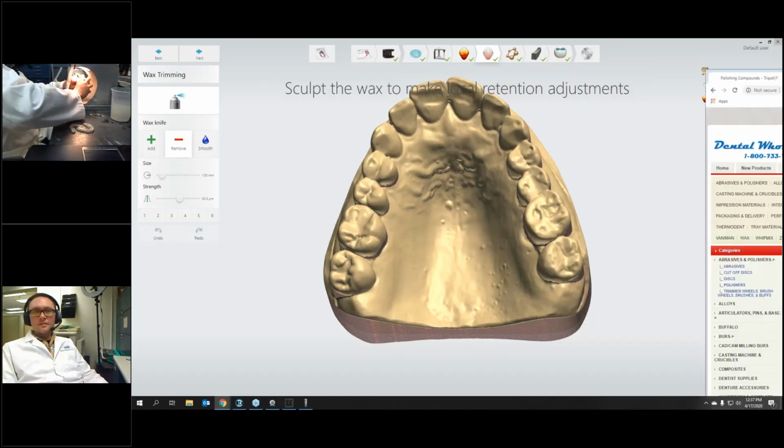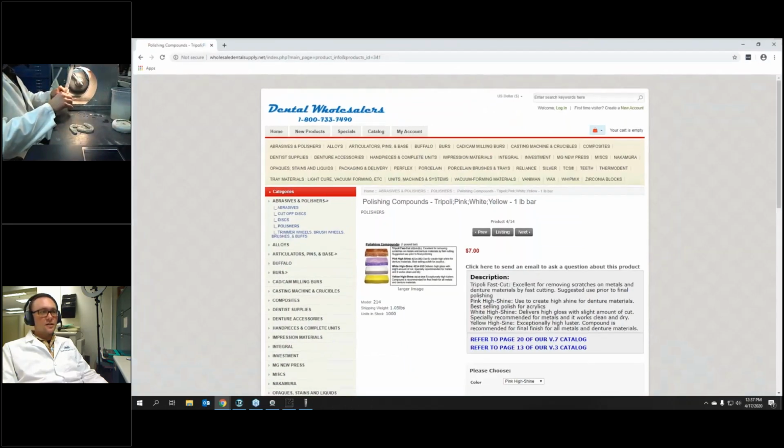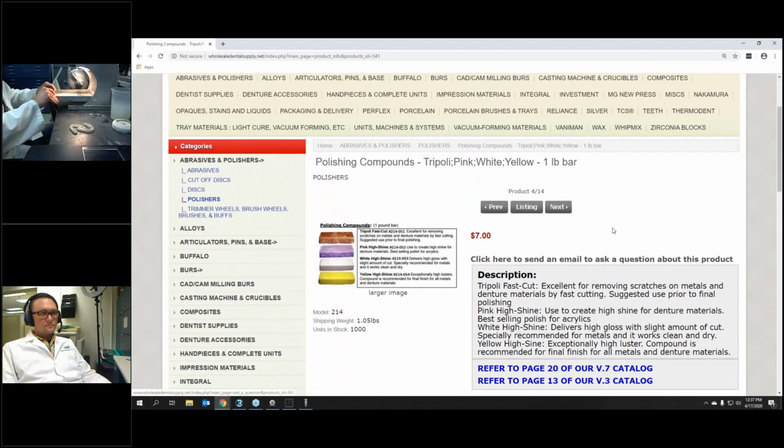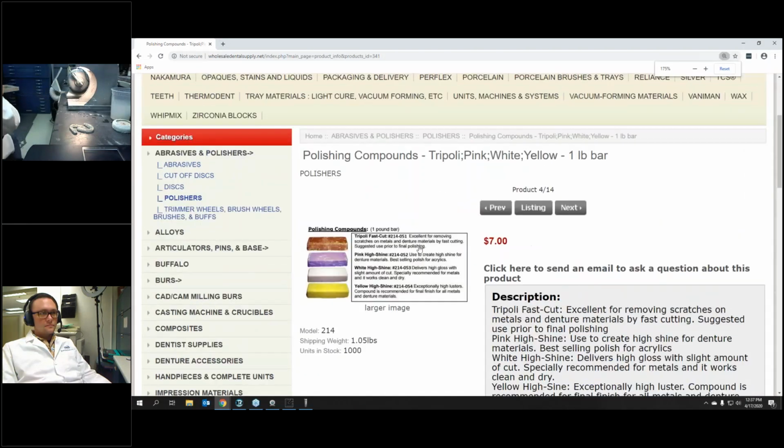So Pavel sent over a link that shows some polishing compounds, so I'm just going to bring that up real quick. Oh, it kind of looks like maybe that purple one there. Yeah, right here. So the purple, or I guess what they're calling pink. Yeah, that would make sense. It's a high shine compound. So yep, thank you, Pavel, for pointing that out. Fairly inexpensive too, $7, and you too can have that at your dental lab or dental office.